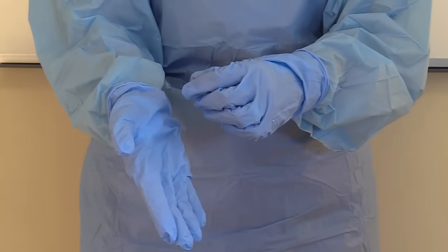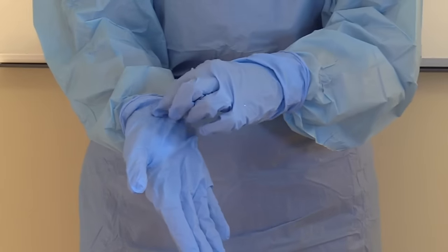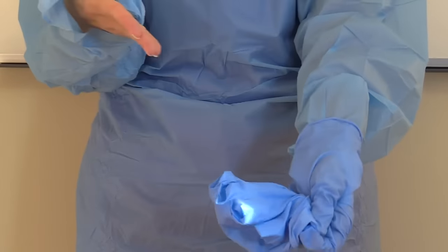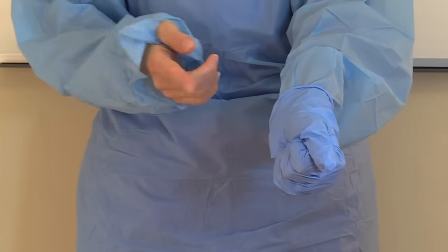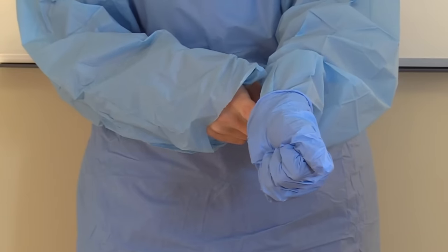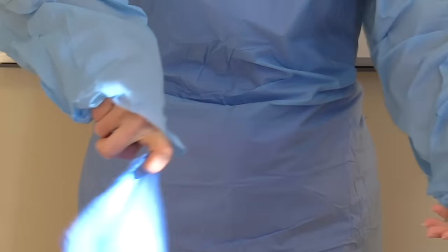First, you will remove the gloves. Take one hand and pinch the cuff of the other glove, then peel it away and grab that glove in the gloved hand. Then take your finger underneath the other glove — remember the inside of the gloves are clean — and just peel it off and discard.